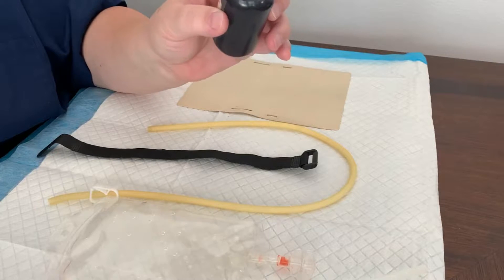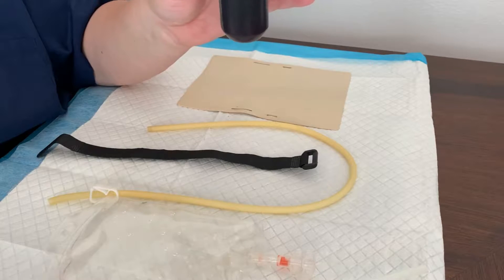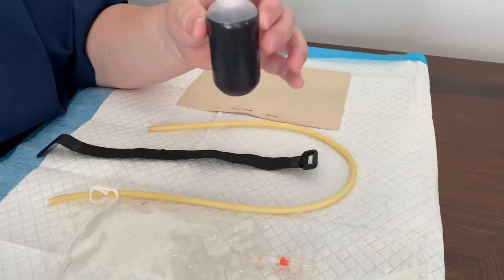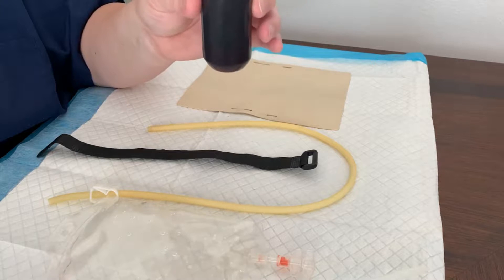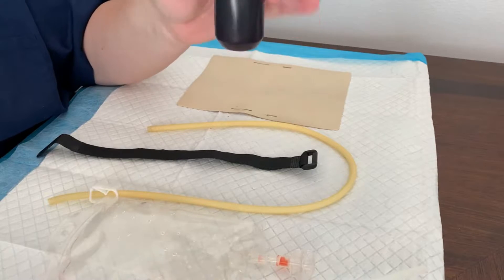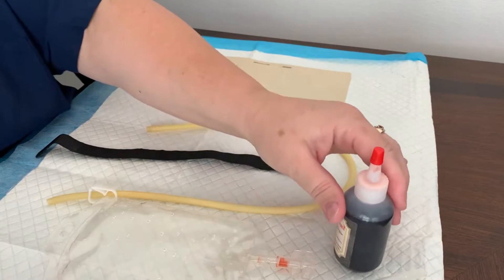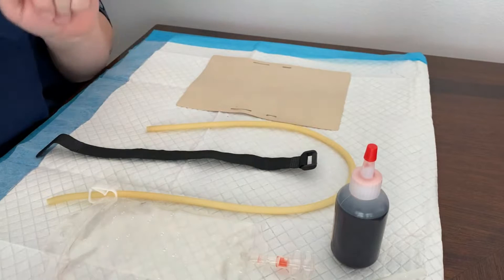This is stage blood and I have diluted it down because it's actually a little bit thick, so it doesn't flow as easily through the tube. It makes it harder to get a flash to show up on your IV. But if you dilute it down, it does fine. So you want your fake blood or any other red liquid.